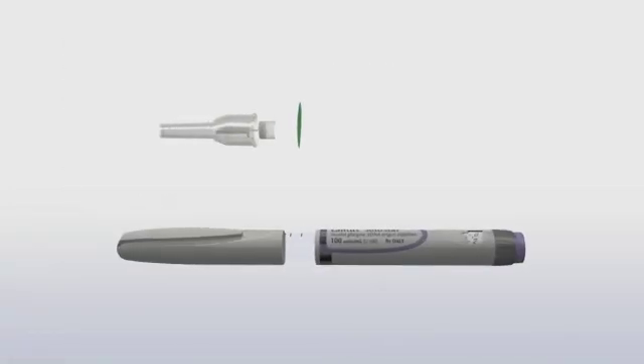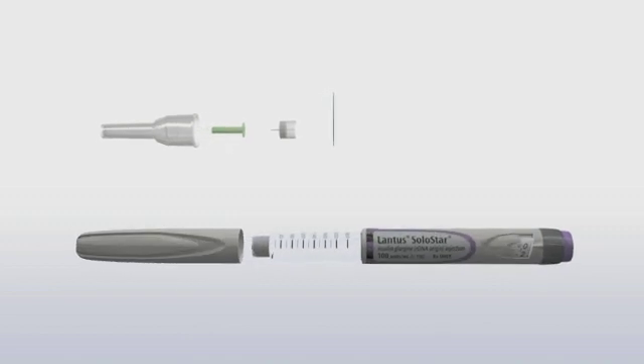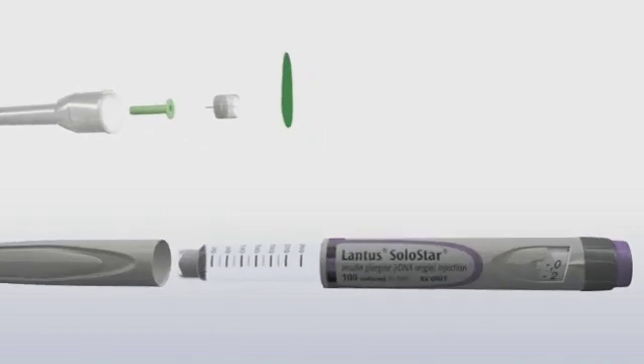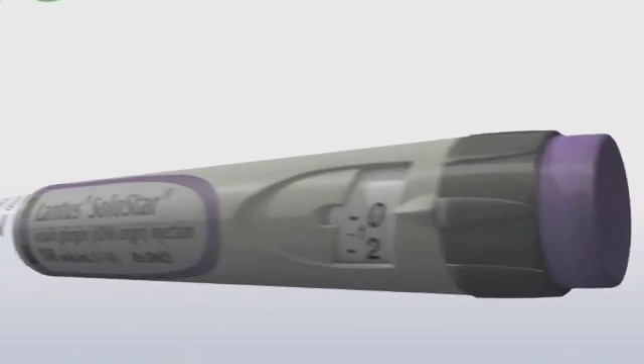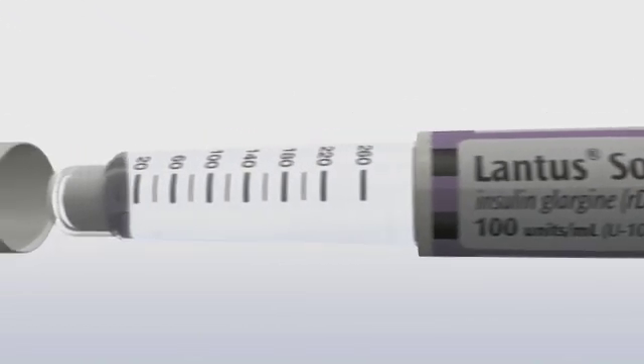Before we start the steps, let's take a look at the different parts of the pen and the needle. The Lantus Solostar pen is gray, has a flat, smooth injection button, and is filled with 300 units of Lantus, a long-acting insulin.